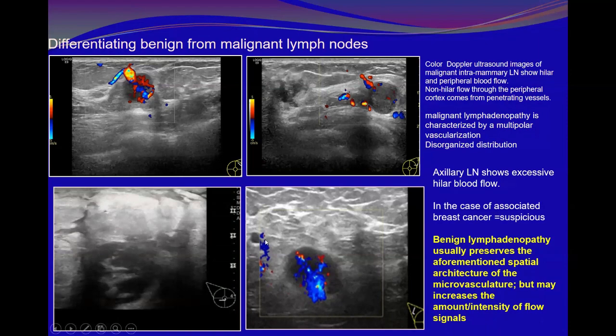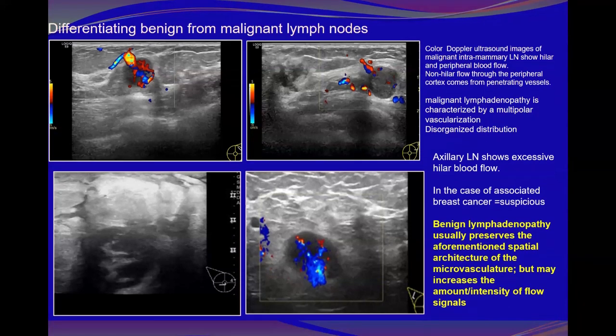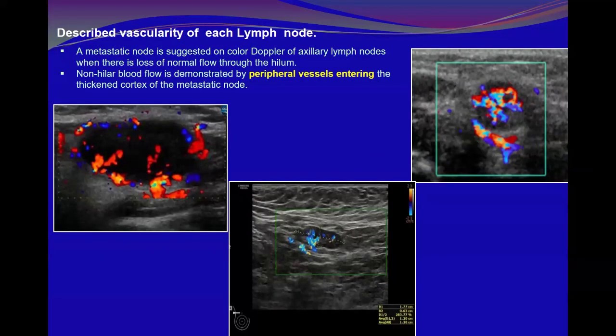This case is associated with inflammatory carcinoma. Here, this is the mass and diffuse edema. We have seen this case earlier in the edema section, okay? And this is the lymph node associated with that one. Definitely this one is highly suspicious and proven to be metastatic cancer.